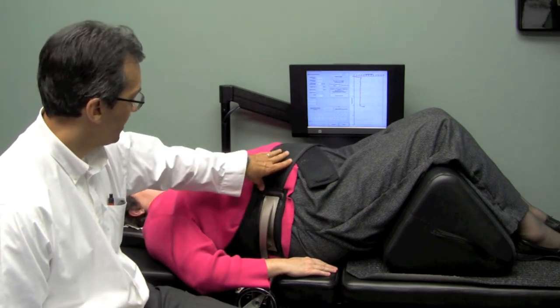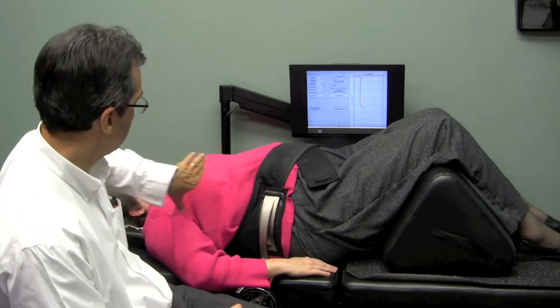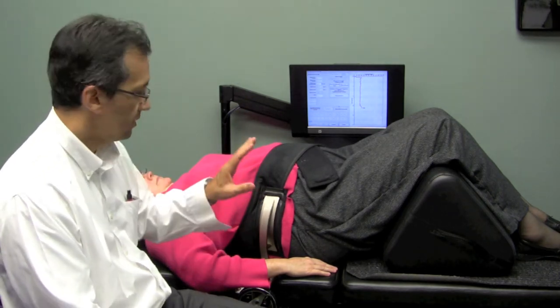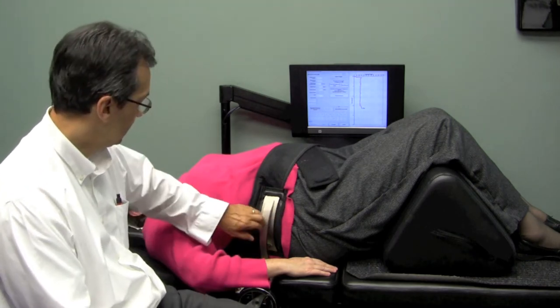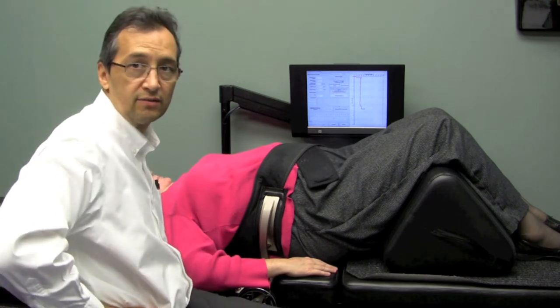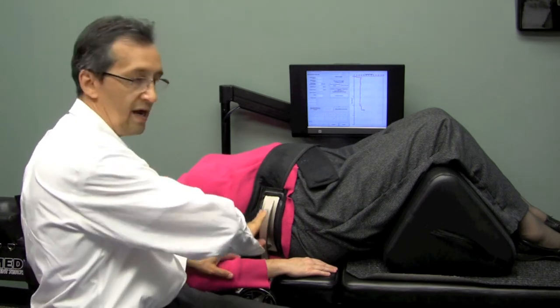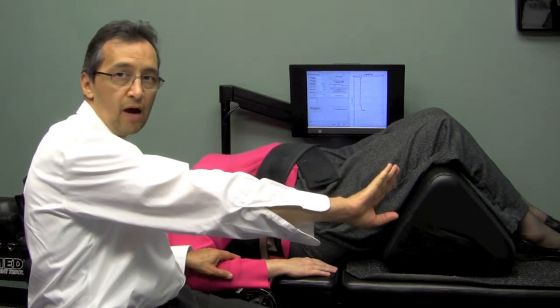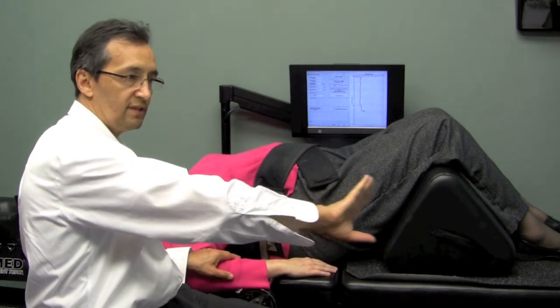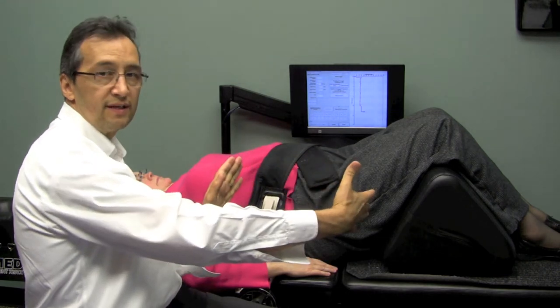We put this strap here around the lower ribs. That secures the upper torso on the upper half of the table, which is stationary. The lower half of the table is connected to these horns. We tighten the horns down on the pelvic crest — the iliac crest or your hip bones — so that when the lower half of the table starts to migrate south, it pulls the pelvis that way, separating the five lumbar vertebrae at the bottom between the pelvis and the ribs.